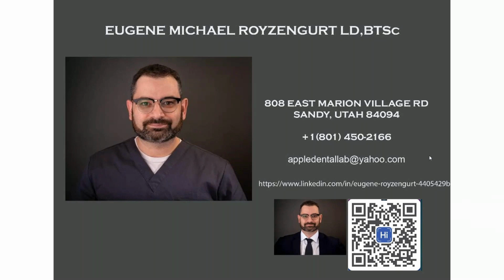Nowadays with digital, duplicating stuff is so much easier. The other day, I got a patient that wasn't sure about their dentures. We did a regular wax try-in, and they were like, oh, I don't know, is it too tall? Is my bite right there? I said, you know what, don't worry about it. Let's do this. I took the case, scanned it in, and printed the whole thing out of try-in resin.